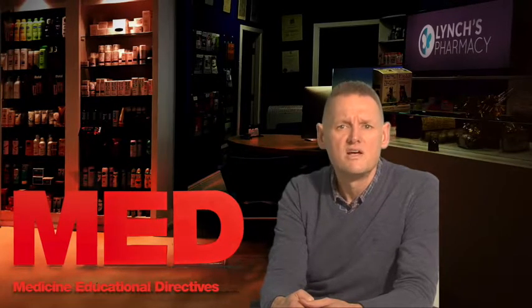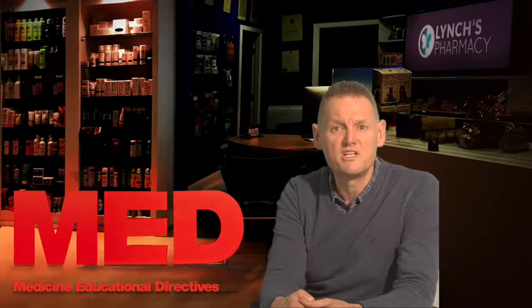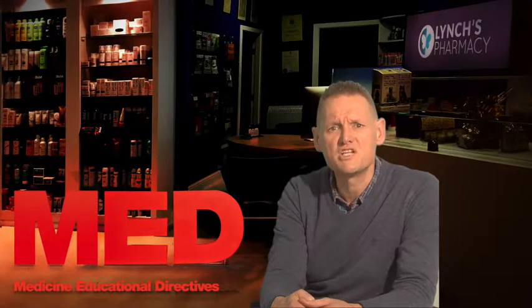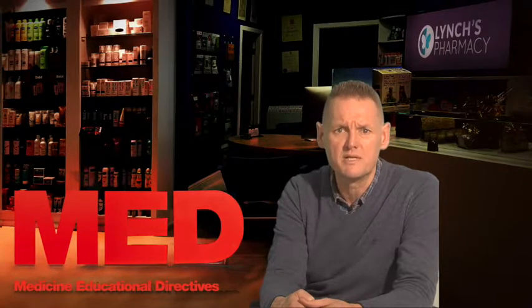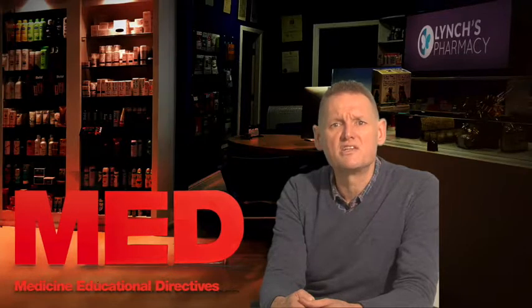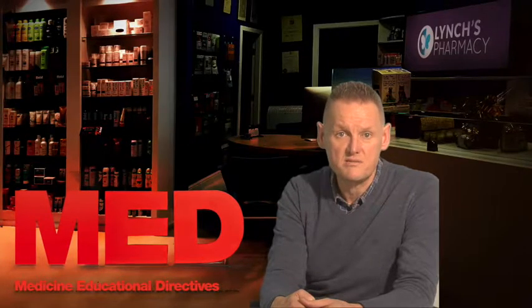So how do I use it? Your doctor or diabetes specialist will teach you how to administer your insulin injections correctly. Apidra injections are given under the skin of the abdomen, thigh or upper arm. You should take care to ensure that the injection does not enter a blood vessel.